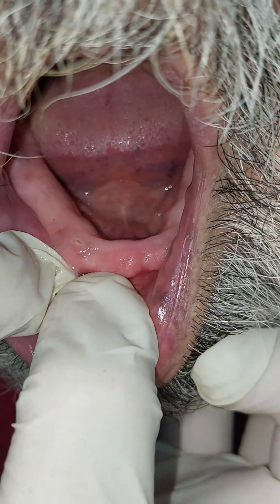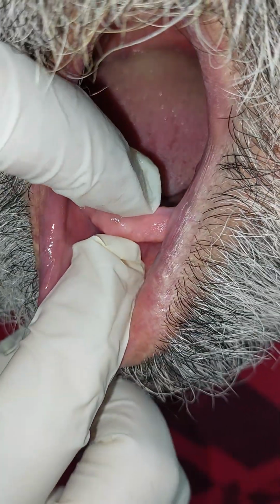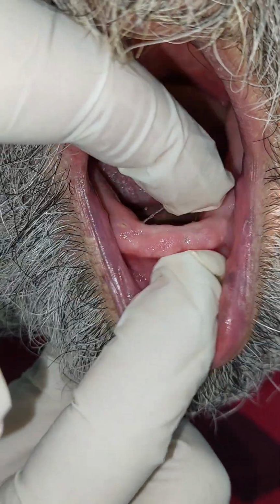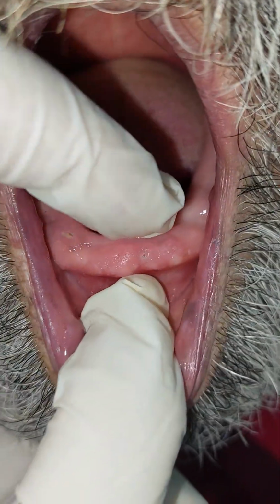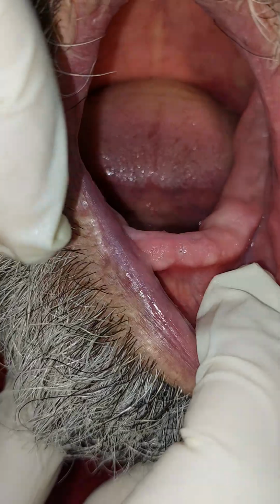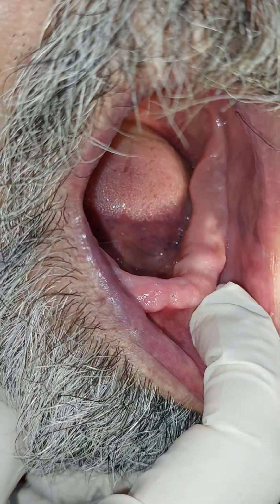So these are exostosis. How do I know they're exostosis, not natural undercut? As I told you, they are close to the teeth. They are C-shaped, and they are all over and irregular. They're not like the natural undercut that we have. Notice that, once more, this is a case where we have encirclement.